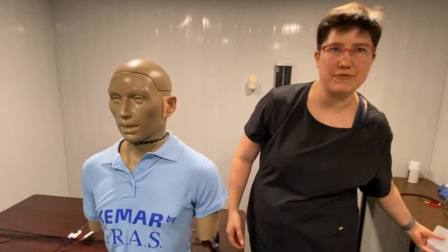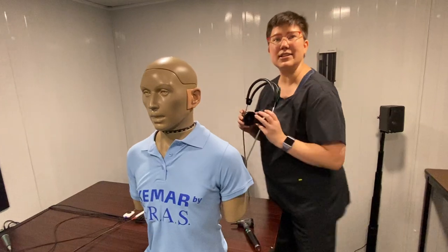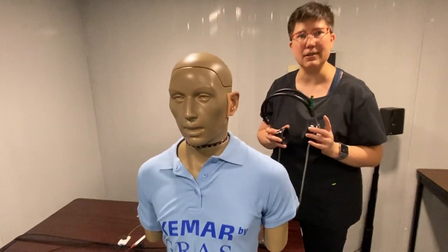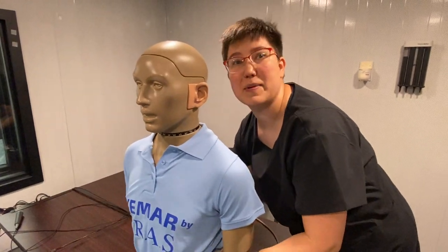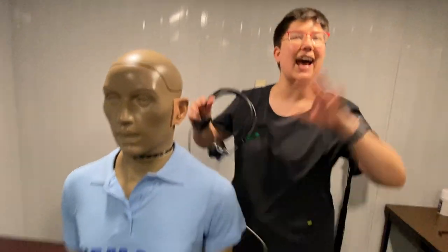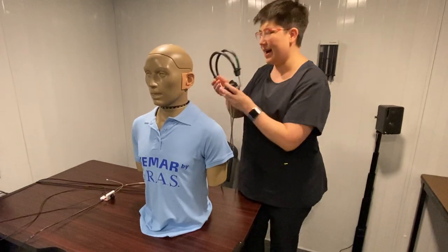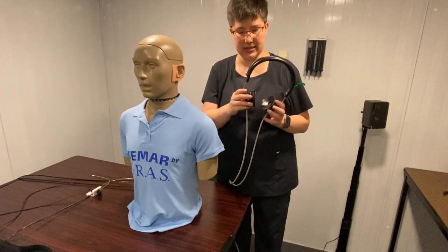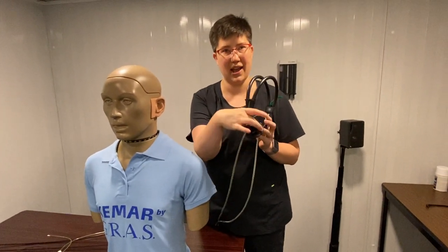Take it as given that I've done all my hand sanitizing. You want to sit or stand behind the person and don't grasp them by the waist — that could be sexual harassment. The right hand is going to hold the right transducer, which is red.